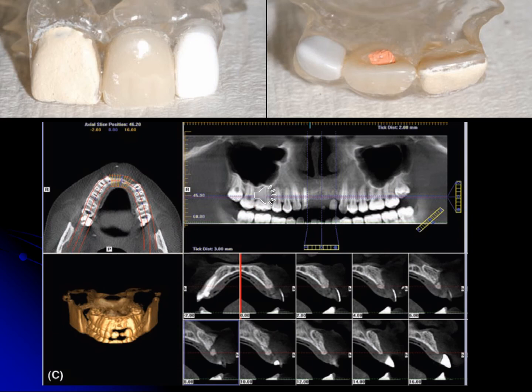In the area of 1-1, we painted temporary bond from the buccal side. That means in this case, we tried three different materials added to the radiographic stent. We can add other radio opaque materials like metallic wires, foils, or amalgam.